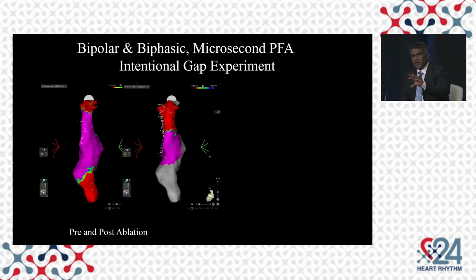I'm going to end with this just to highlight why contact in tubular structures is important. So in this particular experiment, we turned one spline off just to see what would happen. So that's the post ablation. You can see that the SVC is isolated.